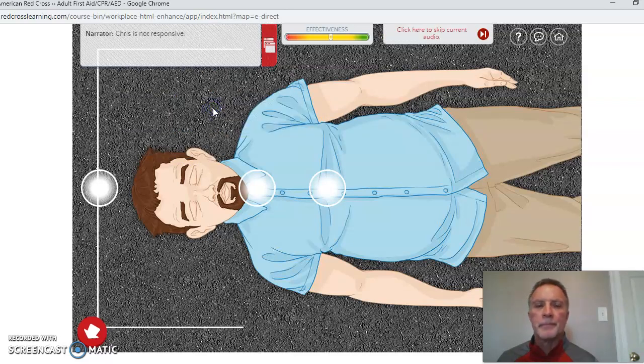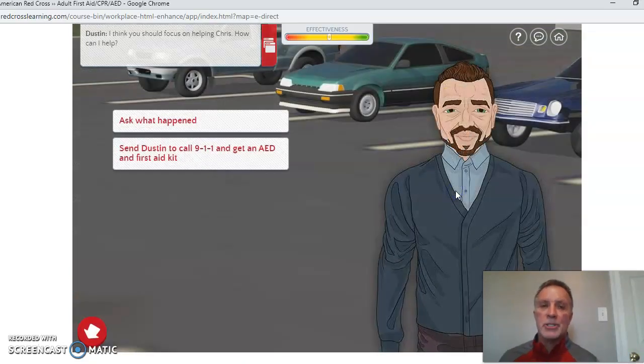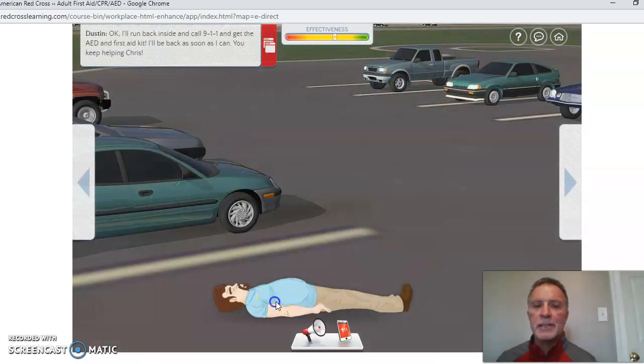Chris is unresponsive. So when we think about that, we did the D and the R. Now he's unresponsive, so we go back to the scene. I think you should focus on helping Chris. How can I help? Okay, we send Dustin to call 911 and get an AED and a first aid kit if he has availability. Okay, I'll run back inside and call 911 and get the AED and first aid kit. I'll be back as soon as I can. You keep helping Chris.